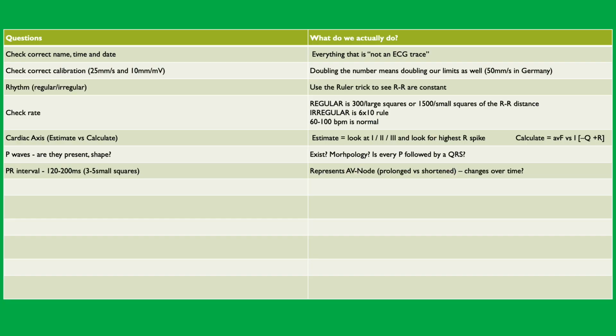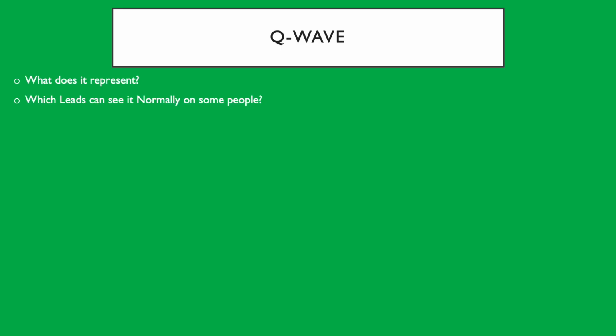So we finished half of the ECG or more than half, and then Q wave. Q wave, what does it represent? Start of ventricular. No. We're talking about electricity, right? So no contractions. It's depolarization, repolarization, only electricity. Okay. No, we're in the ventricle. Ventricular depolarization? Yeah, ventricular.